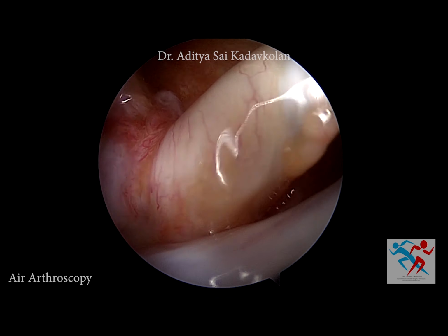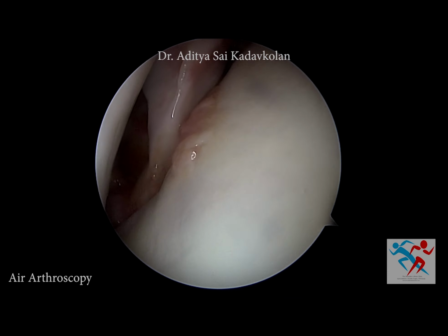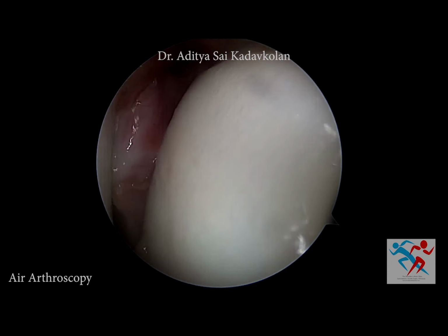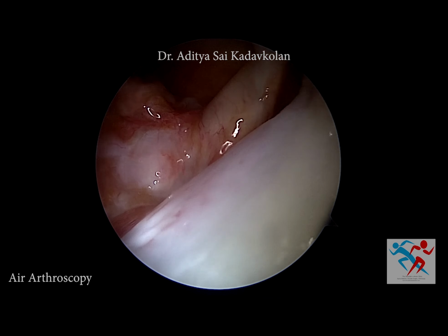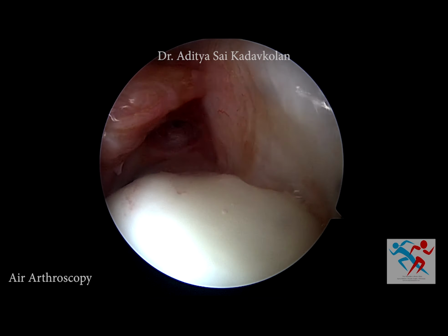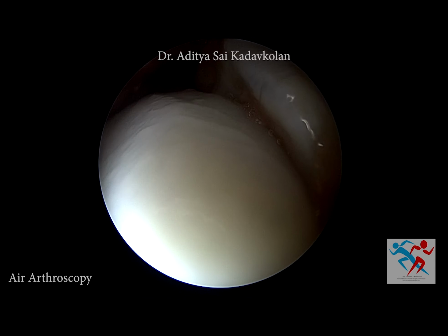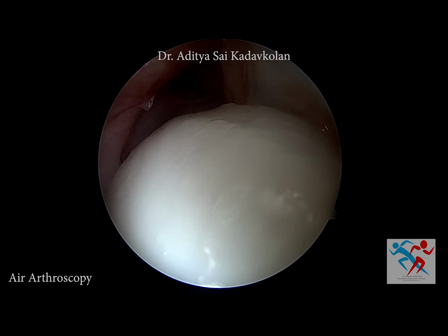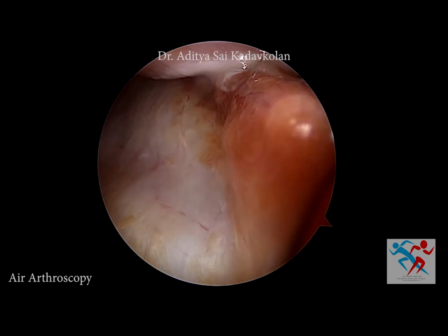This is the torn ligaments in the front of the socket which have come off and which we will be repairing in this procedure. So normally these torn ligaments which you saw there should be attached to the socket. And then this is the ball.